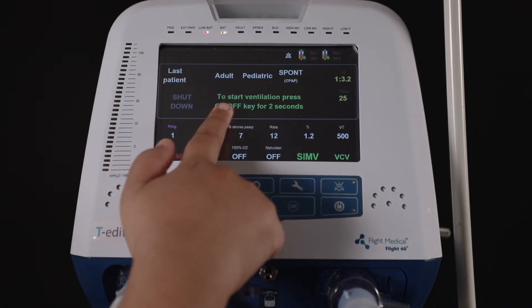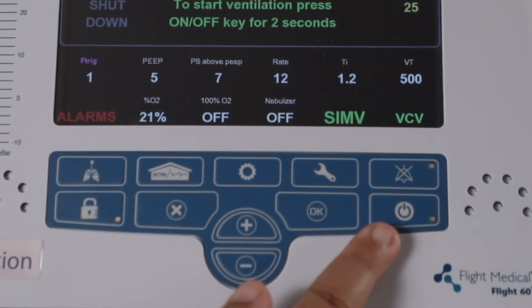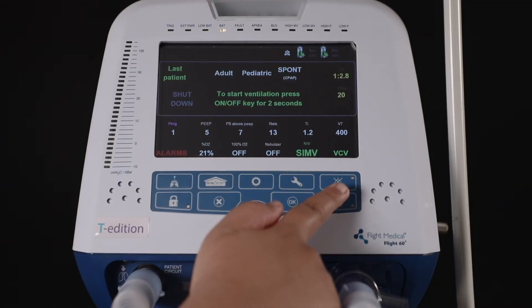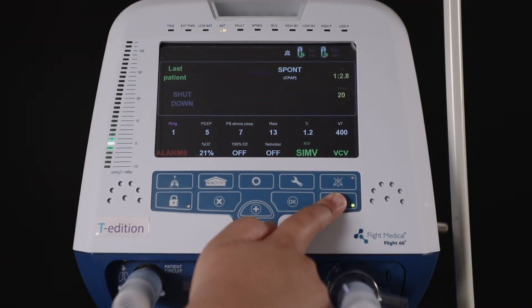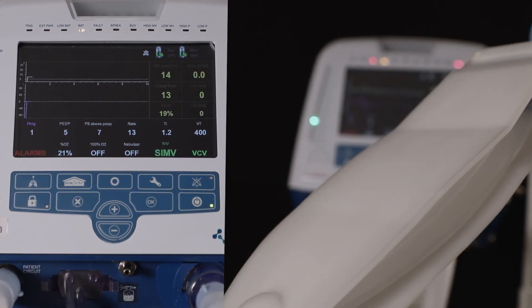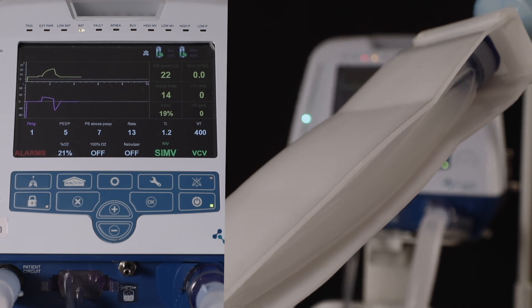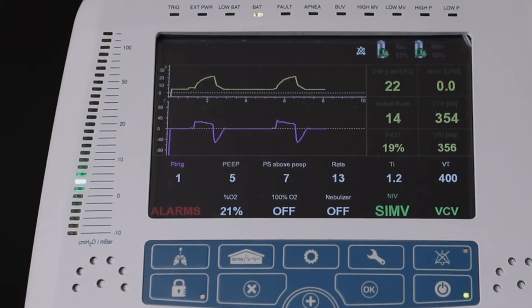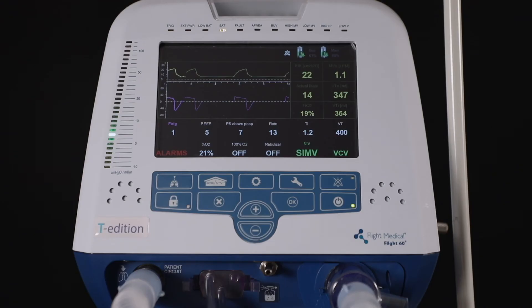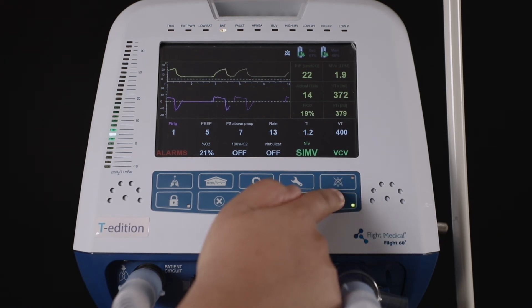To start ventilation, press the on/off key for two seconds. The user will see a green light on the on/off key once ventilation has started. The parameters appear on the screen and the green LED on the left moves upward as the breath is given.